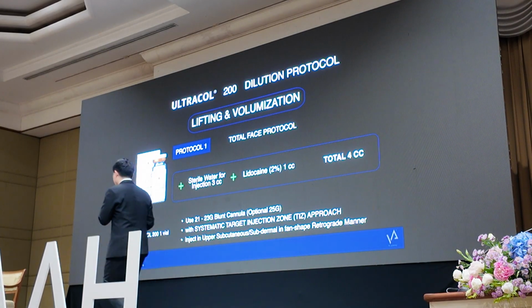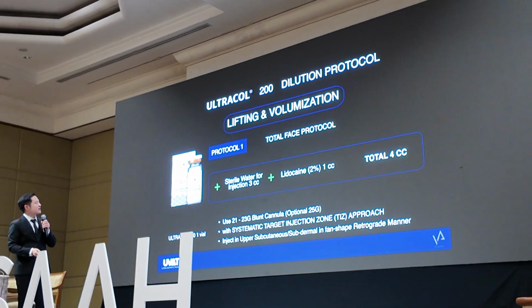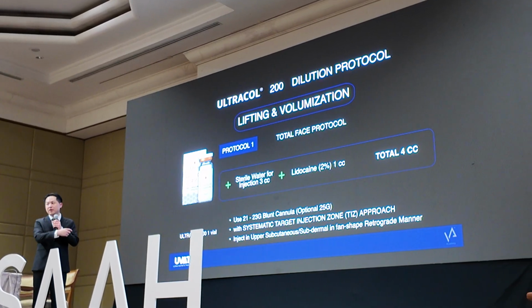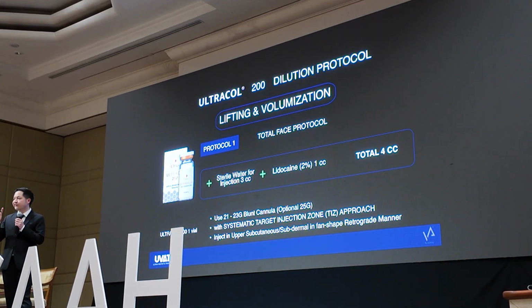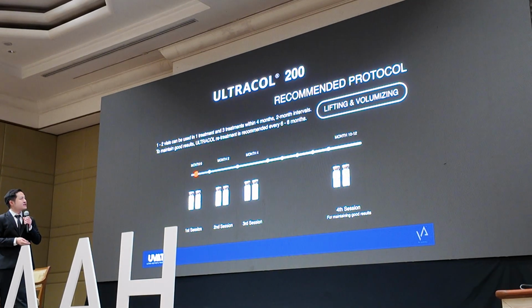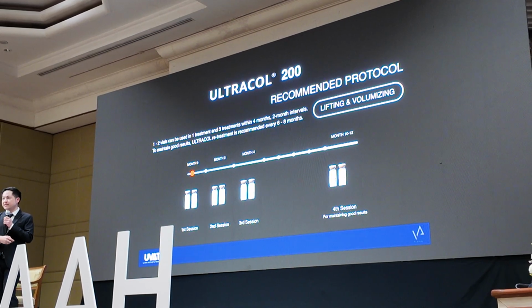Okay, may I move to this side? It's better. Okay. When we reconstitute, as I talked before, 1 vial of the PDO microsphere, we can have 4 milliliters. So in this case, I will use 2 vials for her. And this is the protocol that we treat her.